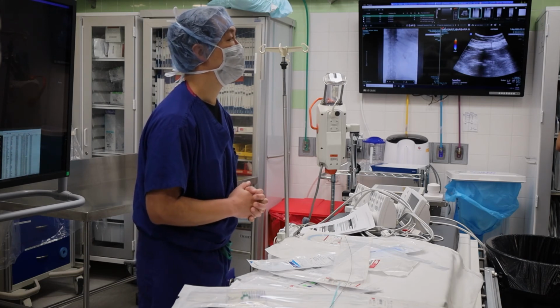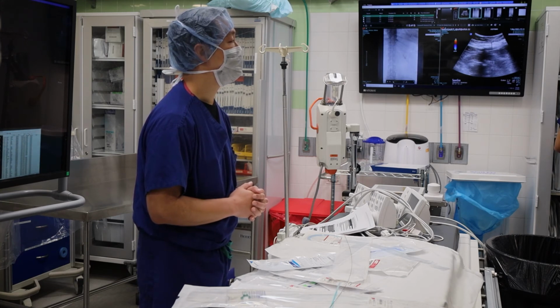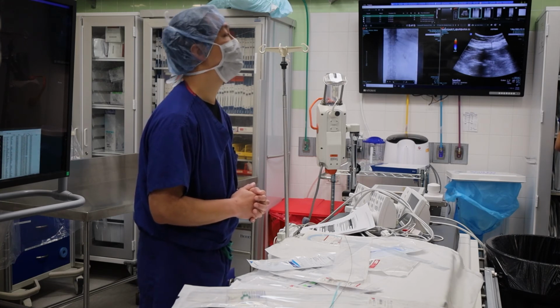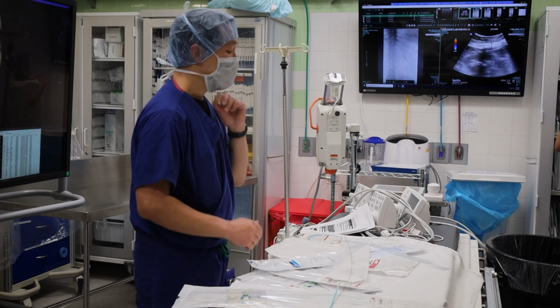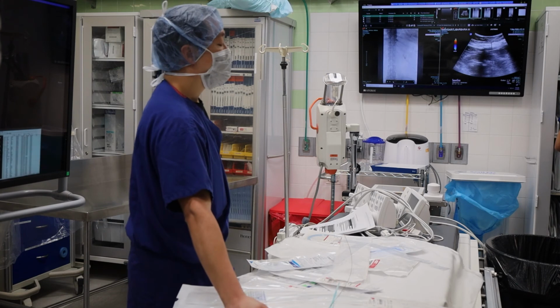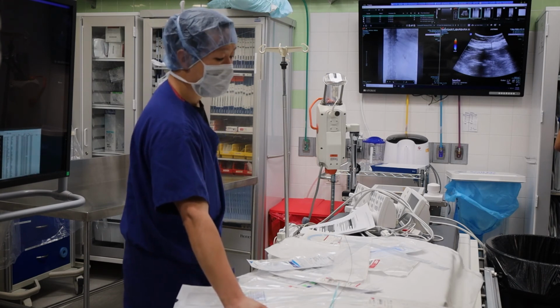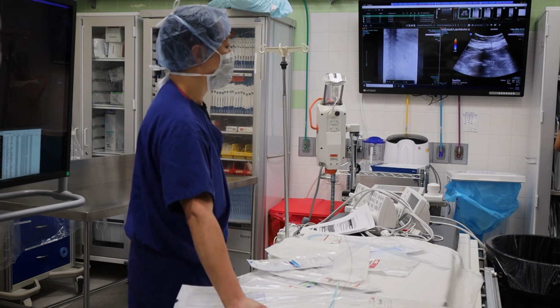Is it a big turnaround for initial placements, like for patients, like you said, septic shock, in the ER, you put a nephrostomy tube in? Is it a fast turnaround, or is it like weeks? It depends on how sick they are, but the majority of cases get better within 2 days or so.